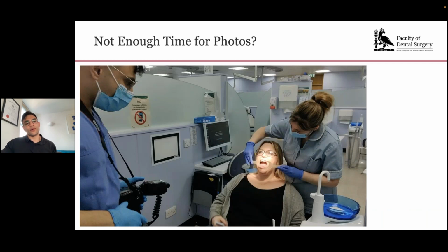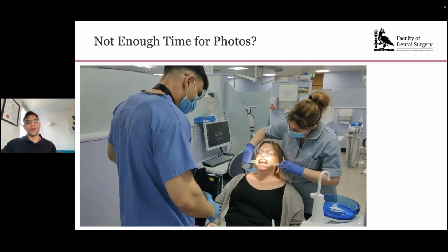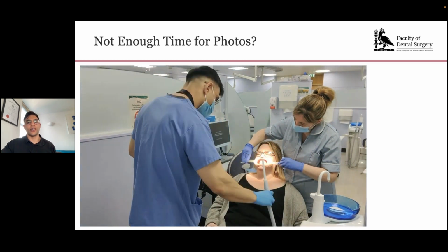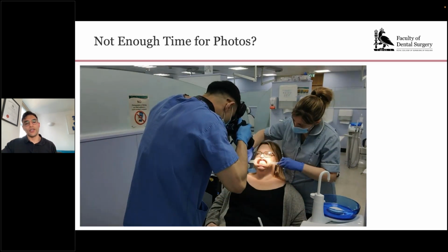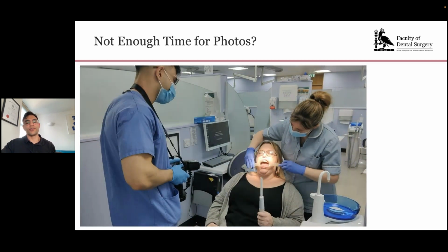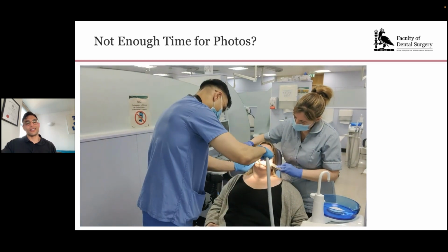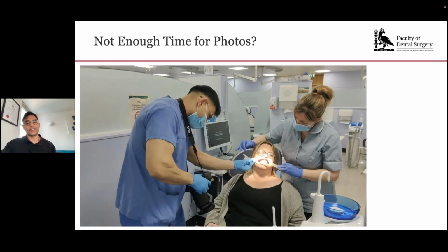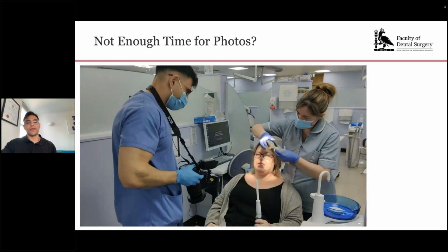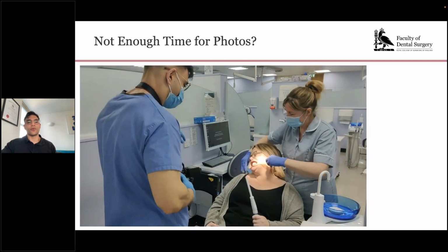And often people say that photographs are onerous and take a long time to take and complete, but really once your assistant and nurse is well trained, once the patient's well trained, they can be taken really efficiently. So you can see here what I've done is I've given the suction to the patient, because saliva ruins photographs, and the patient knows to hold the suction in front of them, and I take the suction from them intermittently and pass it back to them. So I'm not leaning over them to get the suction and putting it back. The assistant knows exactly what they're doing and knows exactly how to get the soft tissues under control with the retractors.